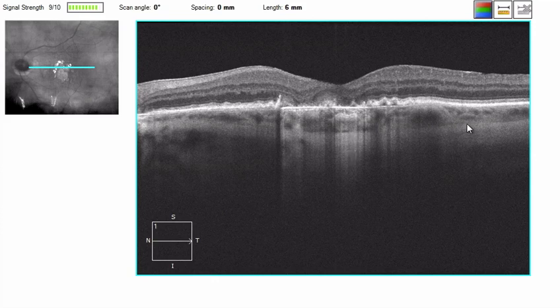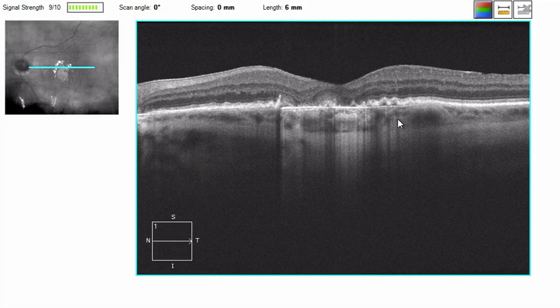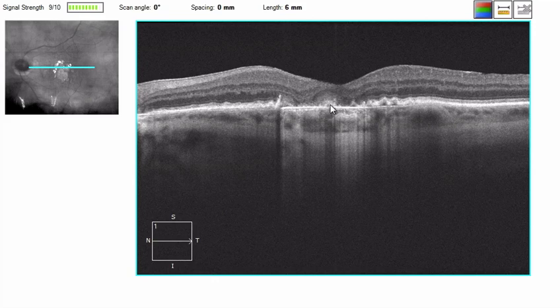Where the RPE is intact, we are able to see the choroidal-scleral junction. As we can see in many eyes, just using standard spectral domain even without EDI mode, we see a larger choroidal vessel here. What is different in the area where the RPE is absent is it is brighter, and that is fairly apparent. We notice an area centrally where there is not increased brightness, and this is where we see some overlying tissue still — likely some remnants of RPE.